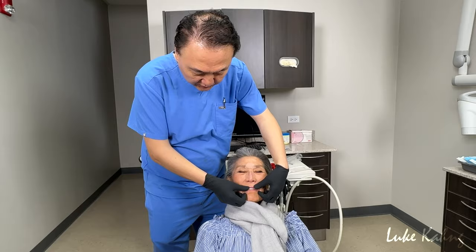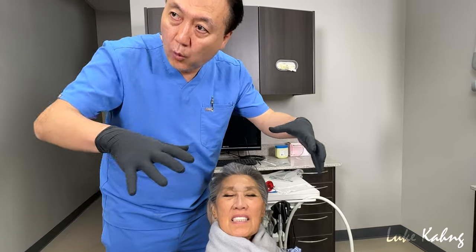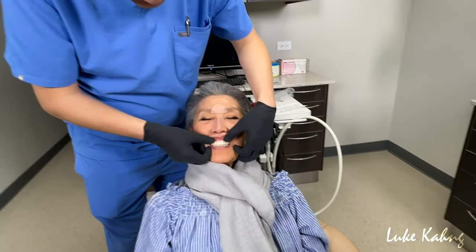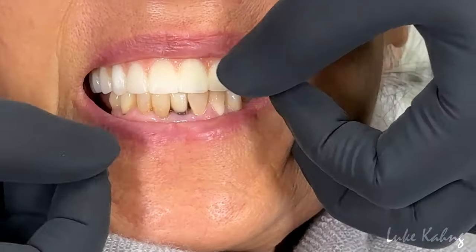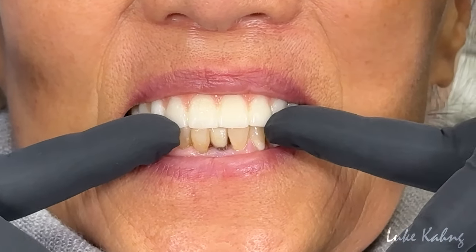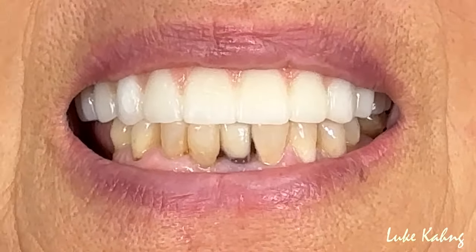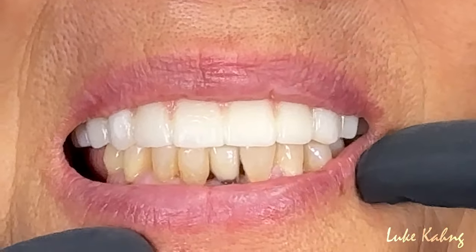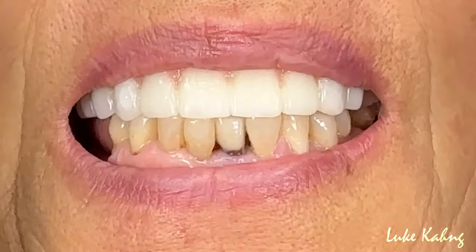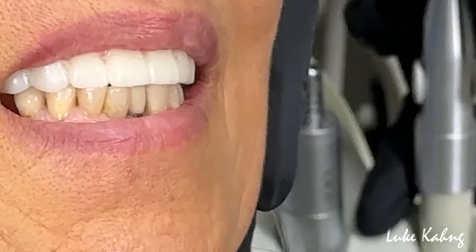Okay, so I'm trying to decrease the buccal fullness a little bit more, which is why I'm grinding, but I wish I could go more down, you see? And then second, increase the tissue up high so I can match the symmetry. That's good. And she's happy about the size and incisor embrasure, which she's happy with. Okay, that's good. So remember, we make 12 teeth instead of 10 teeth. And then the midline we can change, just make sure the whole nose, everything, the midline changes. And then the side view.